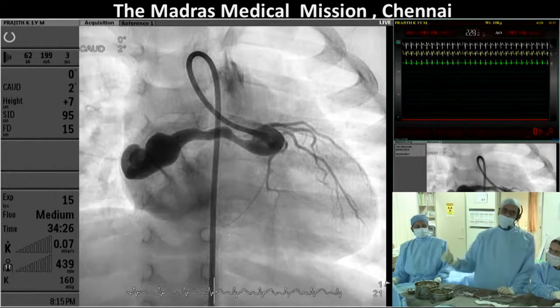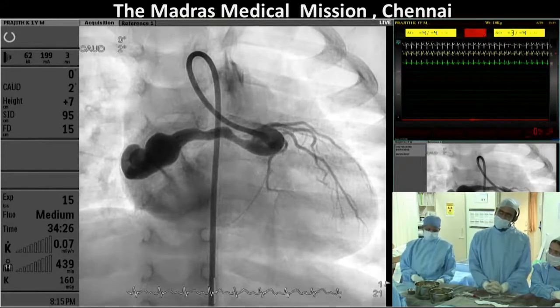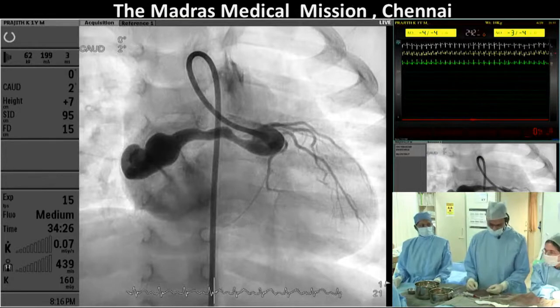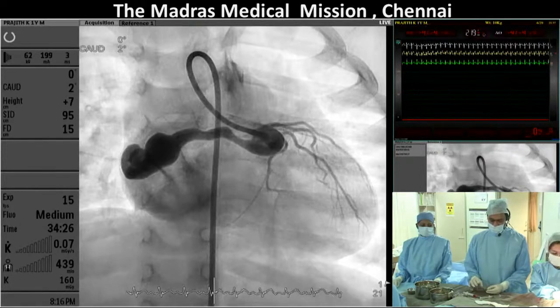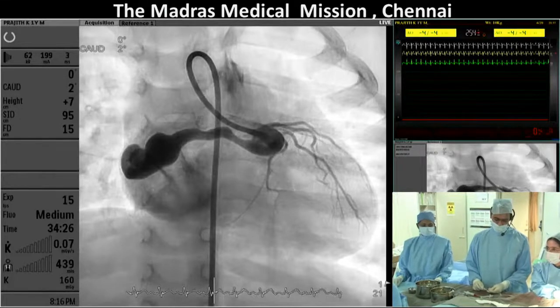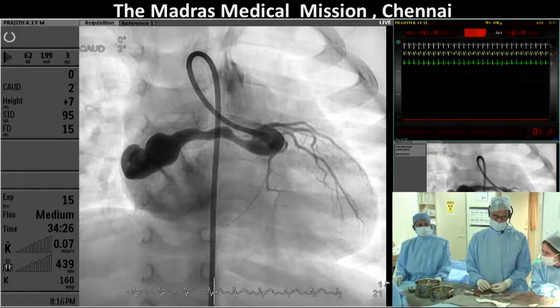Let me ask the following question. If you were on the aortic side, Shiva, hold on. Let Jim make a suggestion. If you were on the aortic side, and you were past the right atrium, even if your catheter tip was right there, or a little farther in, if you put a 5mm coil, what would happen to that 5mm coil? It would tumble and close a hole. And then if you put another 5mm coil, it will tumble and close a hole.